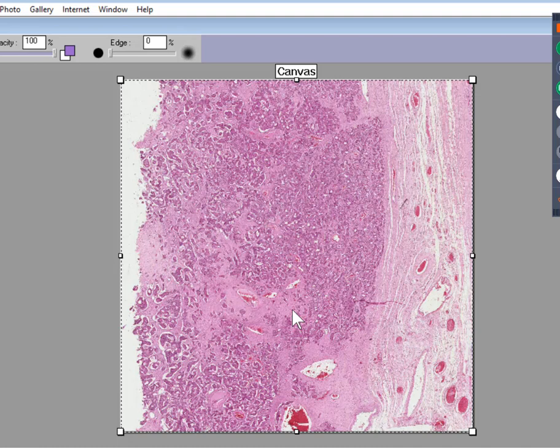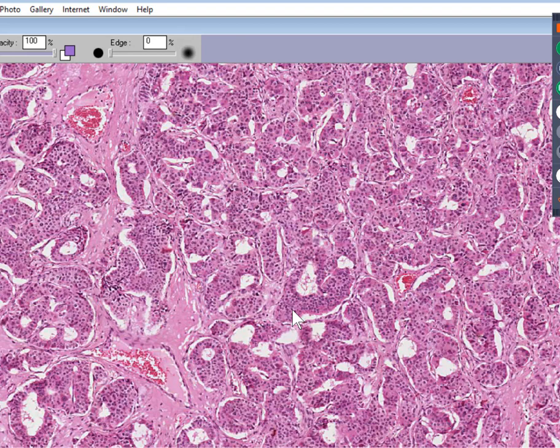And what if I told you again that this was another testicle? And you can see some connective tissue and blood vessels here on the right. And then you can see these darker and perhaps more irregular cells occupying the majority of this field. And then you just want to blow it up, which is what we're going to do.